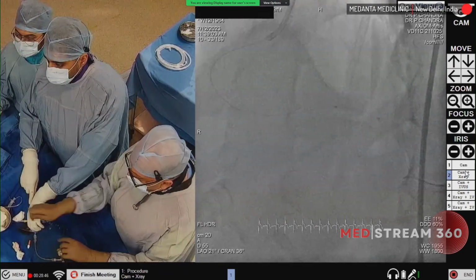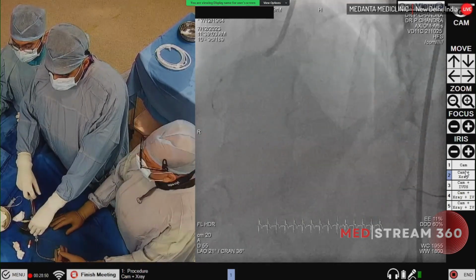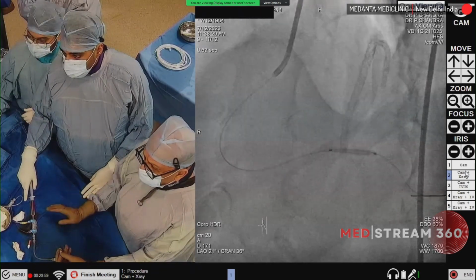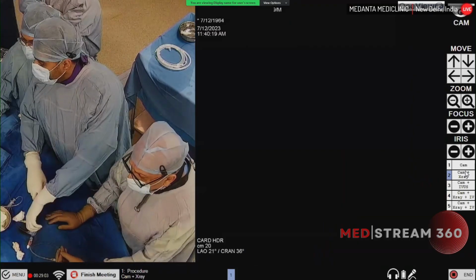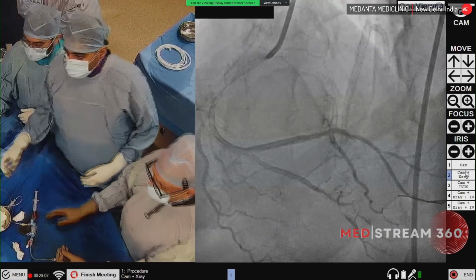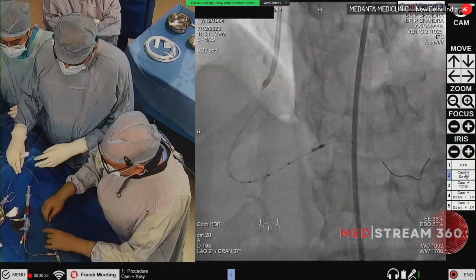So now which drug-eluting balloon are we going to take? Typically now since the sirolimus-eluting balloons are available, should we take a 20 or a 25? That's the question. Take a shot, please. This looks very nice. I think 25 will be better. Give me a 25.